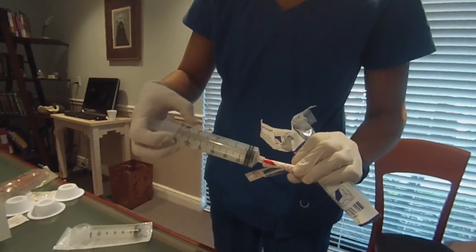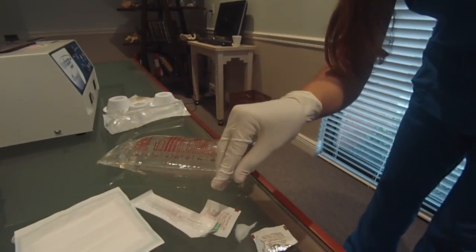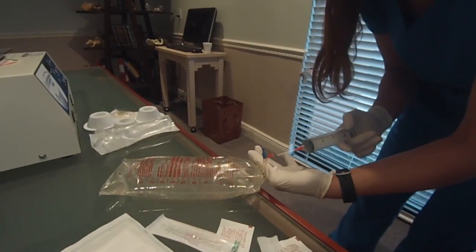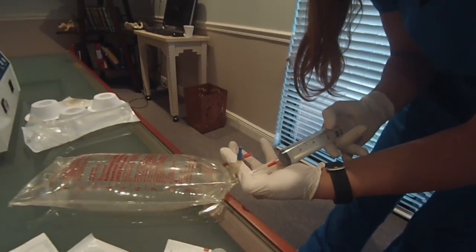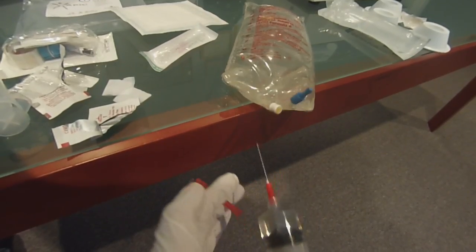Using the components in kit number one for blood collection, connect a red blunt fill needle to each of the 60mL syringes. Alcohol swab the ACDA port and insert the blunt fill needle into the bag. Collect seven mLs of ACDA into each of the 60mL syringes.